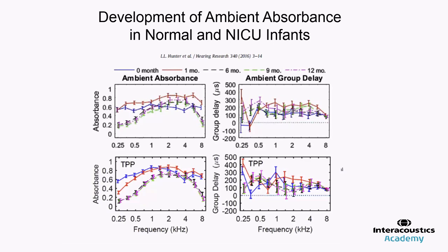So since then, I've done some more studies assessing babies longitudinally. And these are normal babies that were born in the normal newborn nursery, as well as babies that were born in the NICU. And this was published recently in Hearing Research. And what we can see is that there's some development of absorbance going on. So I'm going to go back to absorbance again. So here, higher is better.